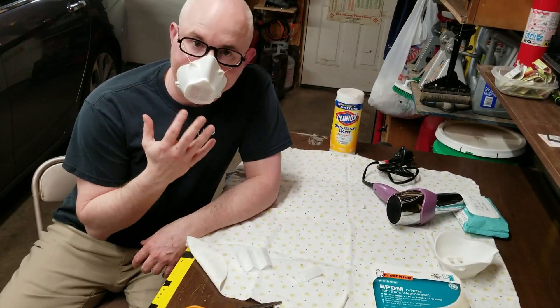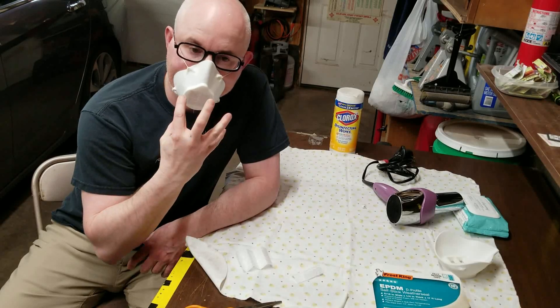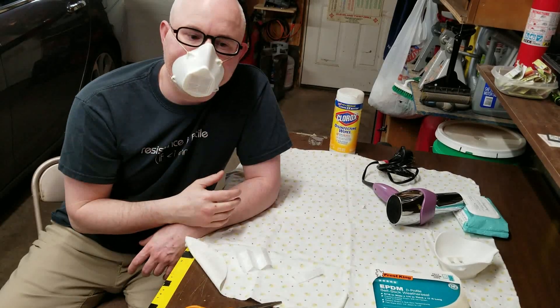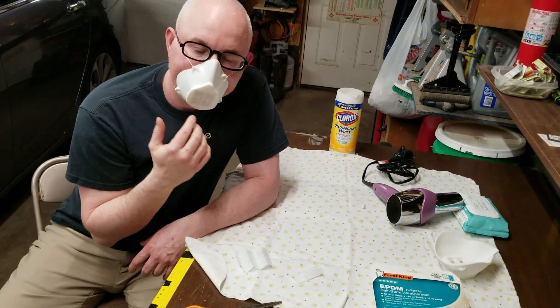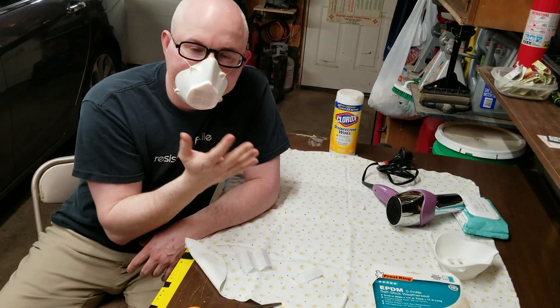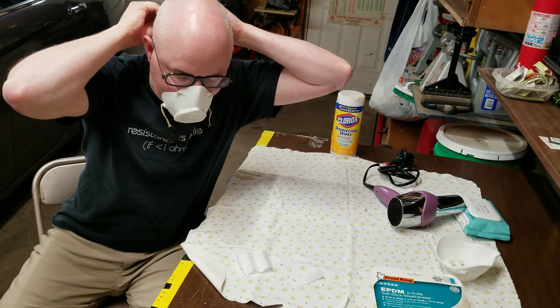If you want to know if you did a good job creating a seal, you do a bit of a vacuum test. What you're going to do is put your hand over the filter area and try to breathe in. If you have a good seal, you should feel the mask sucked to your face. I'm actually unable to breathe in when I simply cover the front of this — I'm not pressing it, just kind of covering it with my hand. That's testing that I have a really good seal around my entire face. Don't do that too many times, but it gives you an example of how you can test that you fitted this thing correctly.